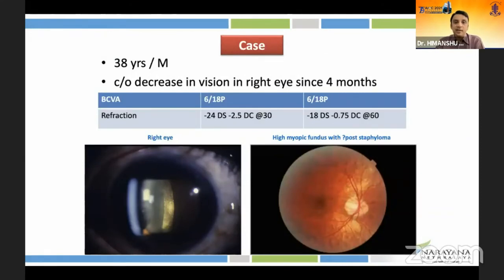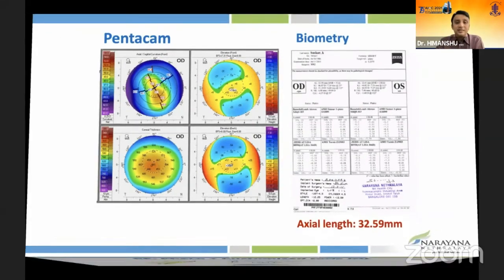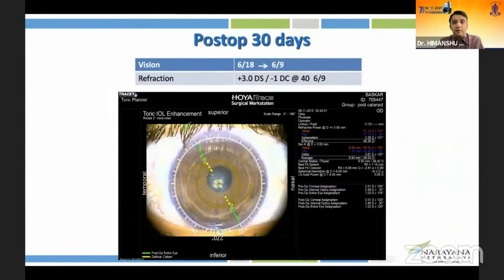Sometimes the person may have keratoconus along with cataract. Typically, allergic patients on long-term steroids can have cataract. In these cases, based on the cone, you may be able to do a customized toric IOL and ultimately achieve a significantly great visual outcome. As you can see from here, the patient could be visually rehabilitated. But if we do not use such high, customized cylindrical power, it's not going to be a great visual outcome.